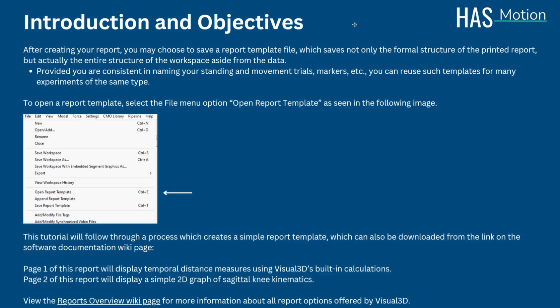To open a report template, we can select the file menu option and select open report template in the Visual 3D application. This is seen in the following image.